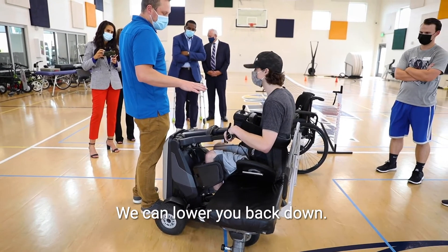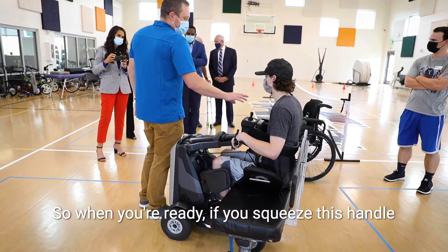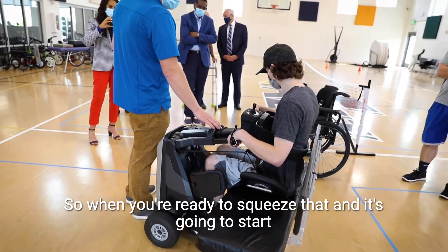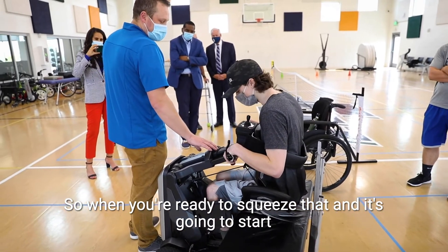Some people have stood for years when they do this. So when you're ready, if you squeeze just this handle, it's going to stand you up. When you're ready to squeeze that, it's going to start to lift you up.